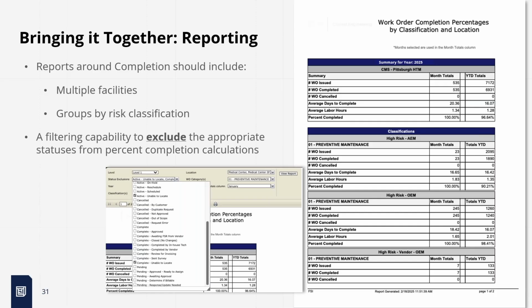Now on medical equipment, obviously your high risk equipment, that's something you're not going to do. But on your non-high risk equipment, is it worth it to take the hit or not? That is probably the question. If I get dinged on this, what happens? That's probably the best way to answer that question.